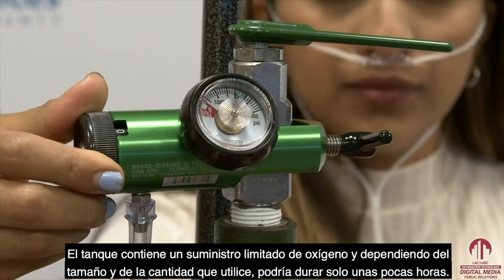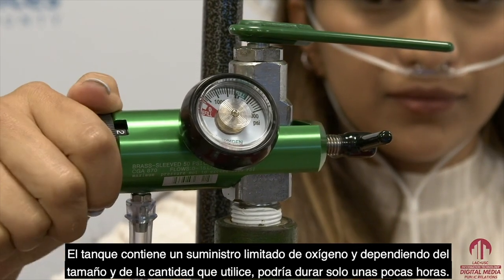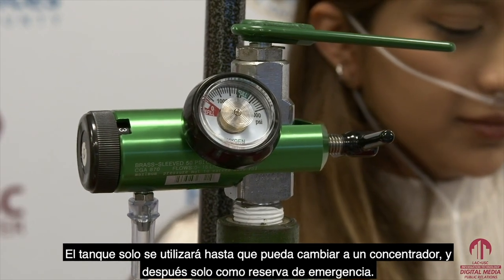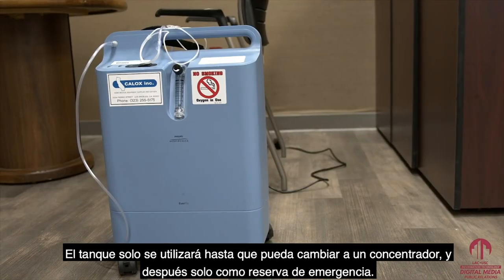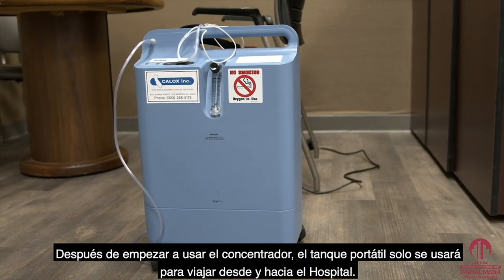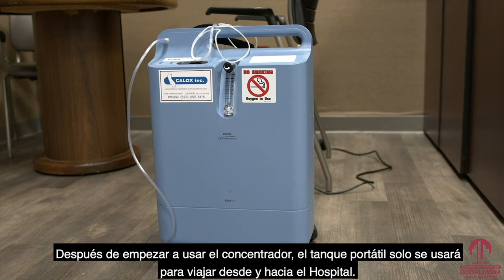The tank contains a limited supply of oxygen. Depending on the size and how much you are using, it could only last for a few hours. So the tank is only meant to be used until you can switch to the concentrator, and then only as an emergency backup. After you start using the concentrator, your portable tank is only for traveling to and from the hospital.